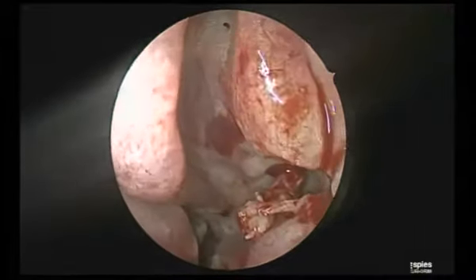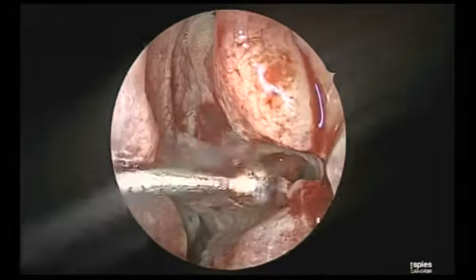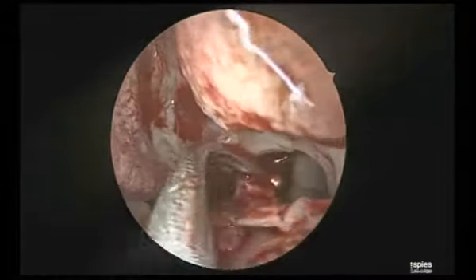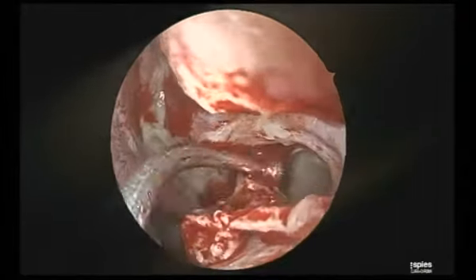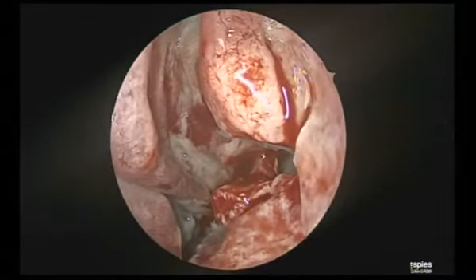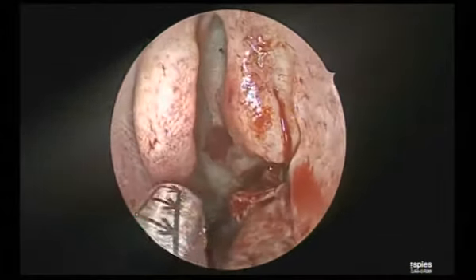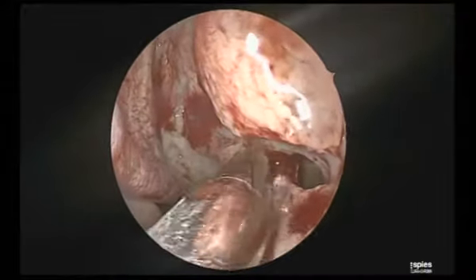See, this lower part of the uncinate, the horizontal part of the uncinate, is surrounded by the mucosa on this side and that side. A lot of people remove this medial mucosa, remove the uncinate, and outturn the mucosa outwards and name it a flap. I have heard people give it names from their city, like Jaipur flap, Bombay flap, Bangalore flap. I really don't care about this. It hardly makes any difference.